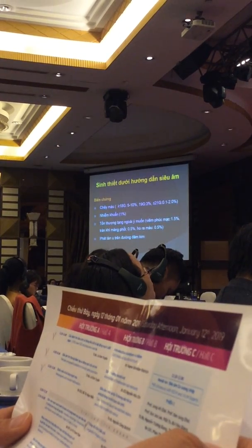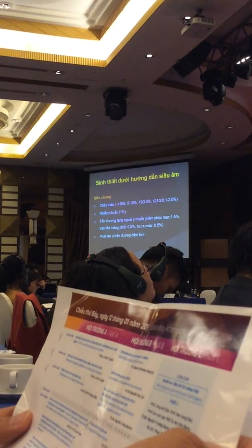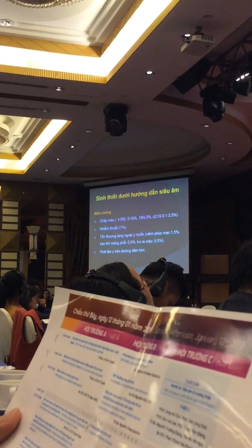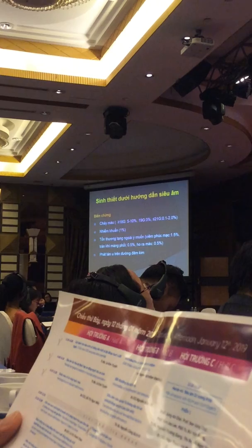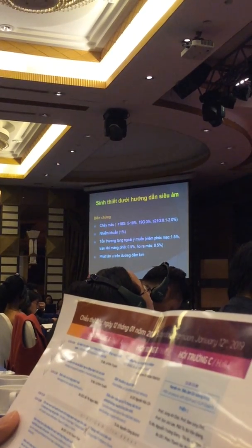It may cause unintended organ injury, not too common with ultrasound guided procedures done properly by an experienced radiologist. There may be tumor seeding of the needle track if you don't follow the proper guideline.